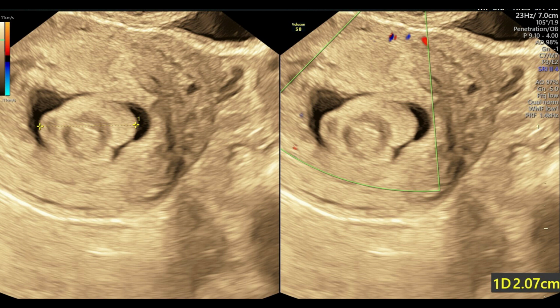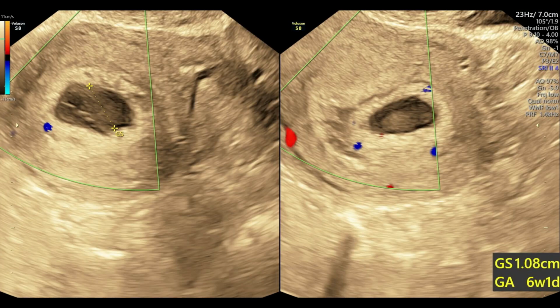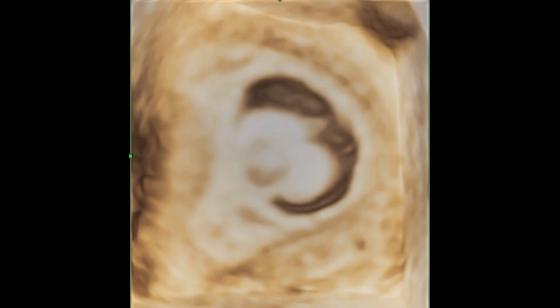I mean, she had no history of abdominal pain or PV bleeding or spotting or any vaginal discharge. You can go through the video, one at 6 weeks and the other at 8 weeks. It has been mentioned there.